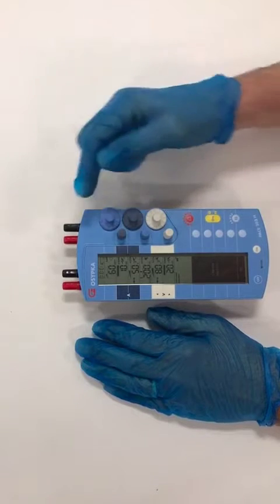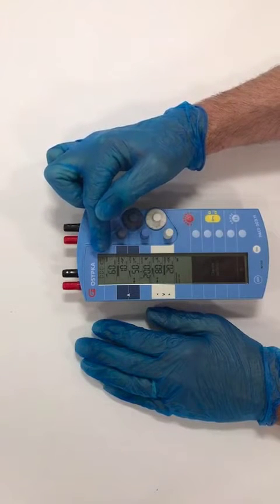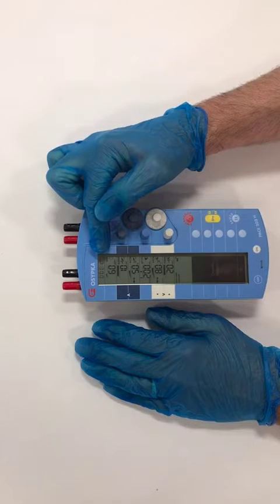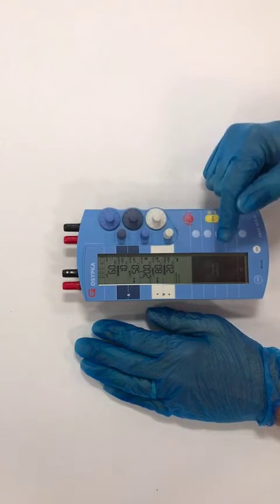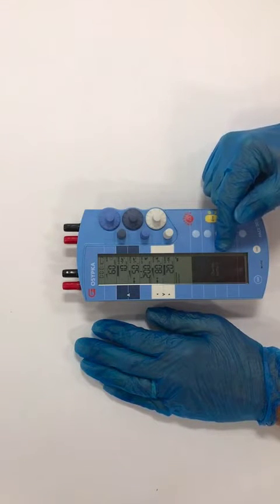Changing the battery. There's a battery indicator at the top of the device which is showing empty. When that occurs, the device makes a sound and there's a message which will say: change battery.